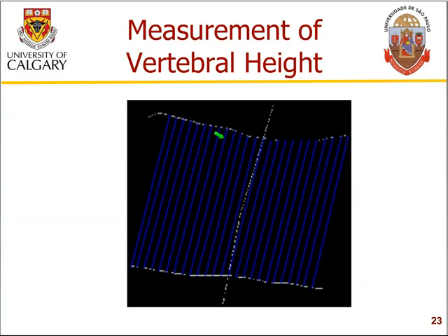The points of intersection were determined and a straight line was fitted between these 2 points, and lines parallel to the new straight line determined were obtained on both sides, and these lines were projected to intersect the edges of the 2 plateaus detected. So these points now give us measurements of the height of the vertebral body at various positions. And there are several such lines.